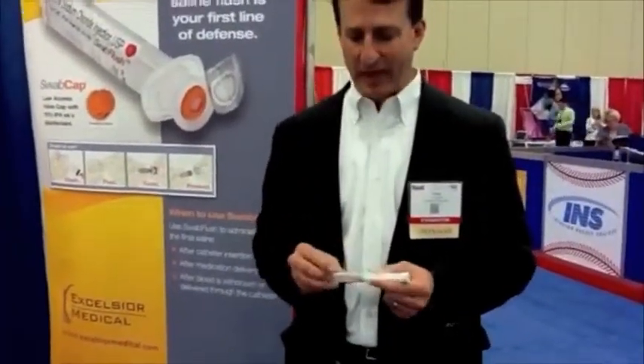Swab Flush basically integrates the best of both features from a pre-filled syringe as well as the Swab Cap product itself. One of the biggest things that we know hospitals rely on, especially from the nursing community, is to use products on a more routine basis. We almost need to incorporate both products into a process that they complete 100% of the time.